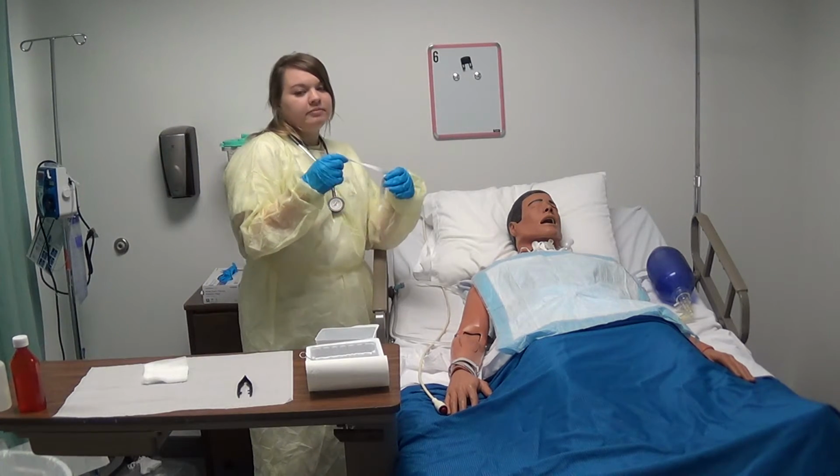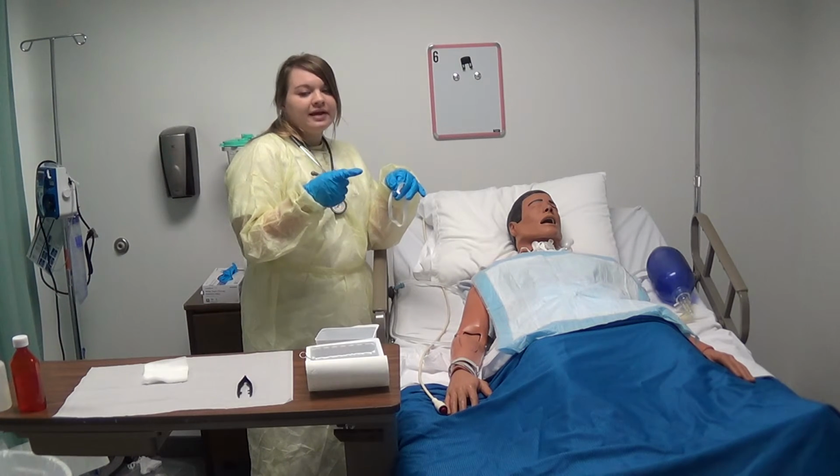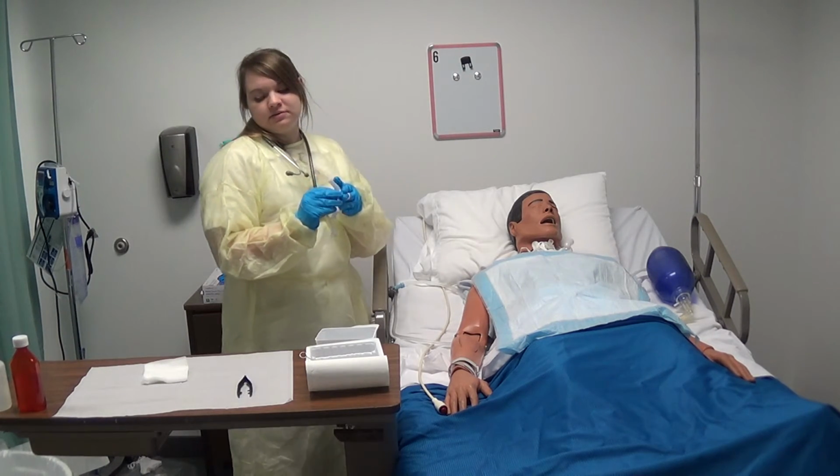I would go ahead and place the new ties, tie them in a knot, make sure they're secure, allowing at least 1 finger breadth between the ties and the patient's skin. Then I would remove the old ties.